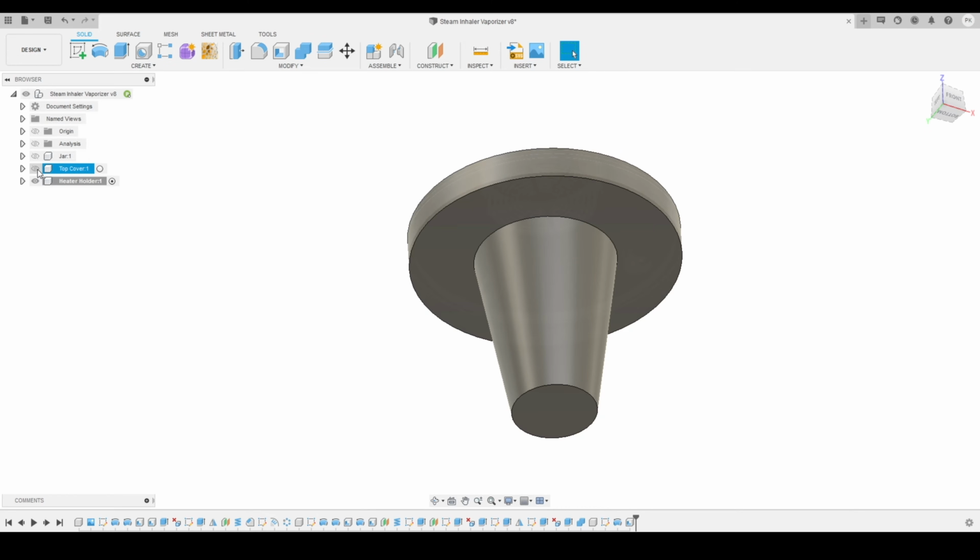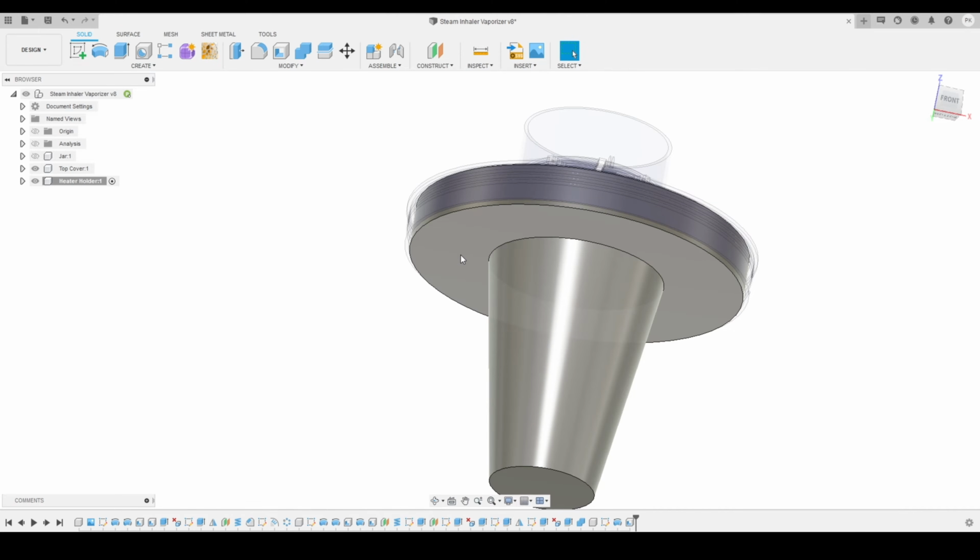So I will go into the design tree, I will turn on the top cover. Here you can see, it is just looking like a wireframe model. So now I'm going to move on to our next step. So I will select this face and I will start creating a sketch on this.